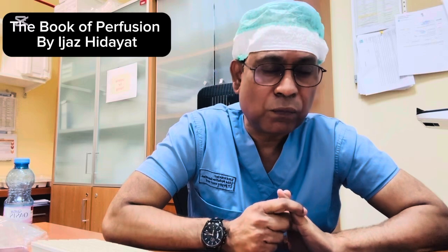First of all, we need to understand no flow, low flow, and full flow. Once you understand no flow, low flow, and full flow, then you can understand the main idea behind ECPR. As medical professionals, we know that if you get a cardiac arrest, no flow is acceptable for only 4 minutes, low flow is acceptable for like 40 to 60 minutes, and we need to achieve full flow within 60 minutes.